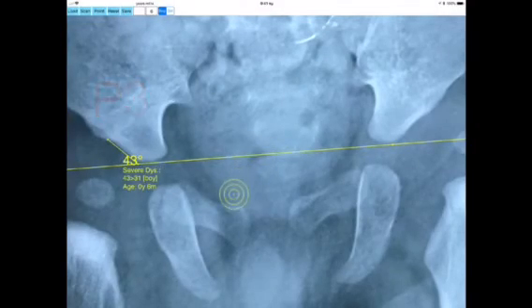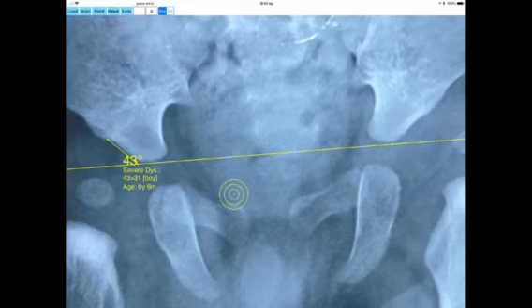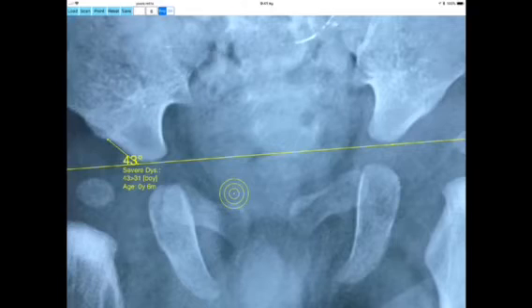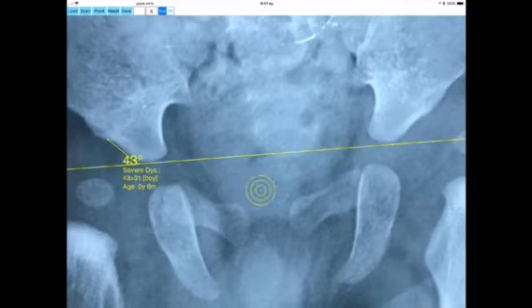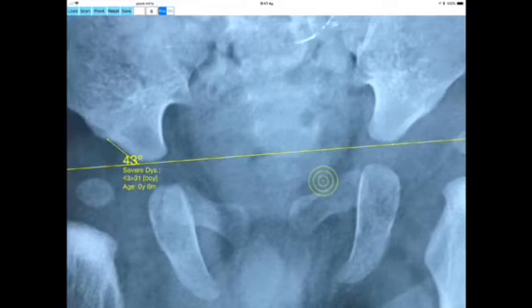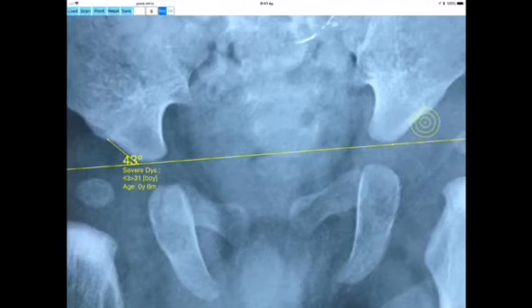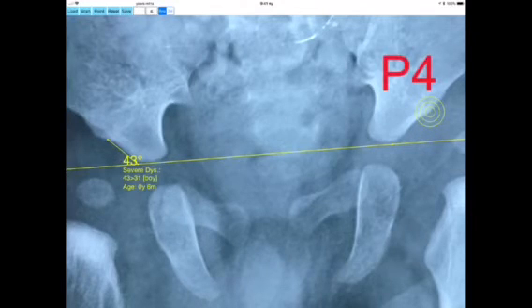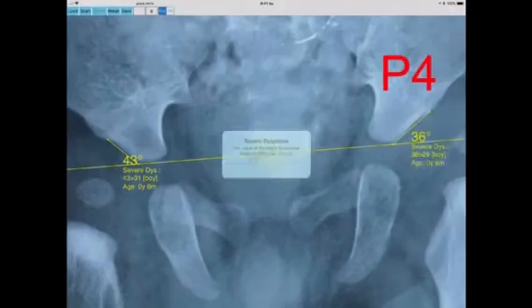Next you choose the fourth point, P4, at the lateral acetabular margin of the left hip. The angle formed by the Hilgenreiner's line and the segment P2-P4 is the AI of the left hip, and is printed on screen near the left hip.